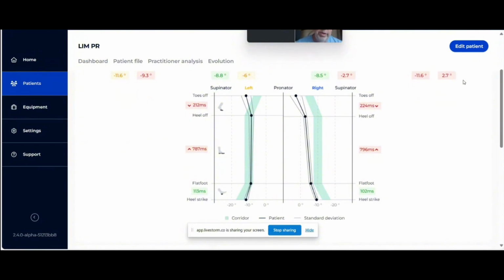And we see she's overcompensating for that on the right side. So this is often associated with just her relative position that we see in there. But I might take this into consideration because I might use an orthotic if I wanted to actually correct this. And that might also correct some of these other deviations or these time courses that are changed as a result of her gait pattern. Also, relative to balance, right?